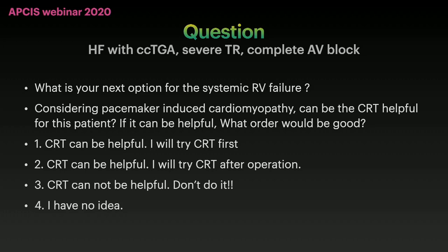What is your next option for this patient? Considering the pacemaker-induced cardiomyopathy component in this patient, can CRT be helpful? If you think it's helpful, what order would be good? There are multiple options. Okay, you can answer.